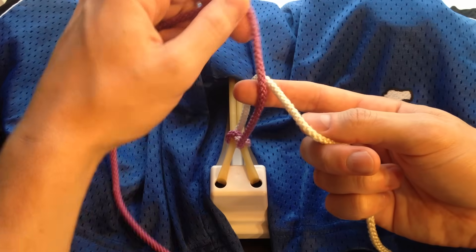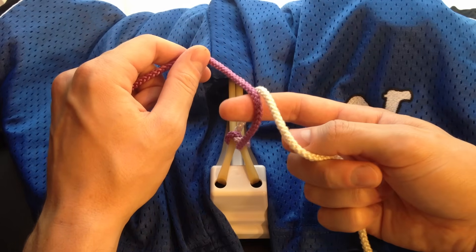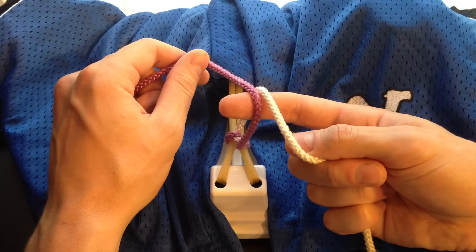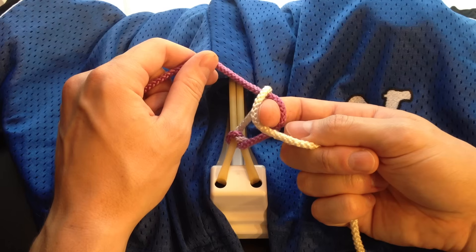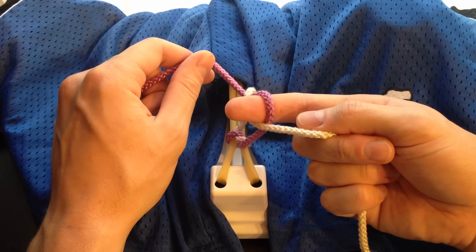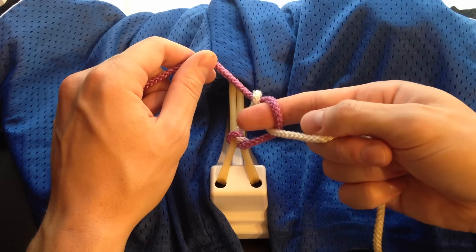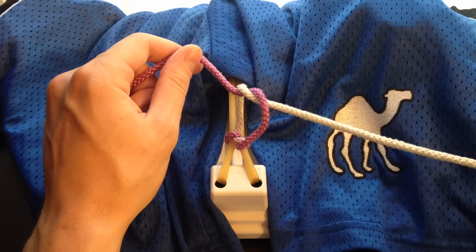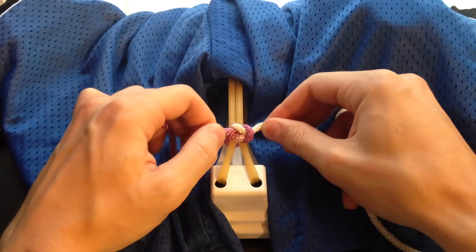You're going to take your post and wrap it over your pointer finger in the opposite direction. The next move is the exact same as before, but this time with your pointer finger — you're going to go over the purple, under the white, again using your thumb to help position it, and extend. Now, we only have one finger, so we can't grab the string. Instead, we're going to rotate it backwards through this loop and pull our free end through. When we pull it tight, we've got our first square knot.